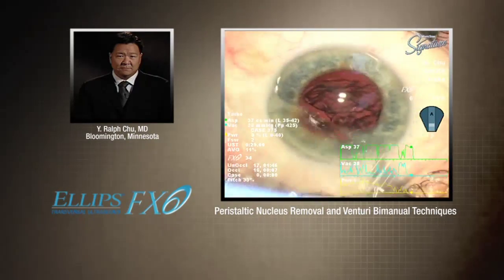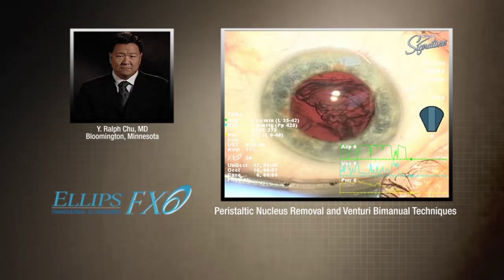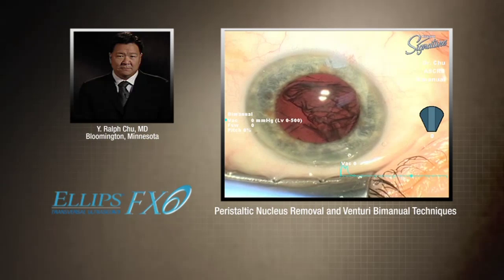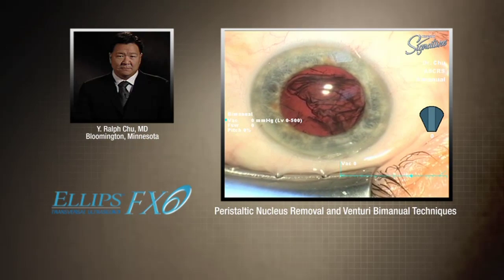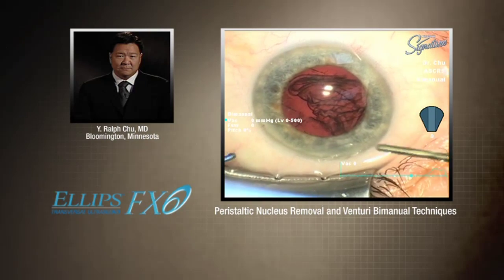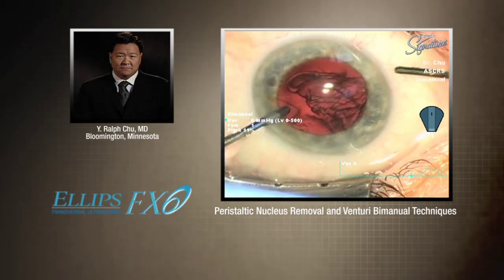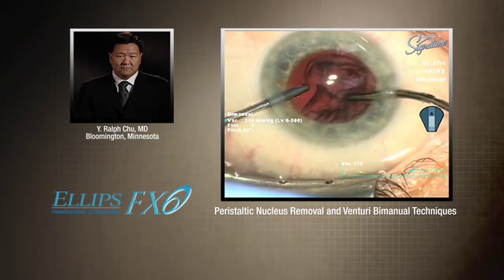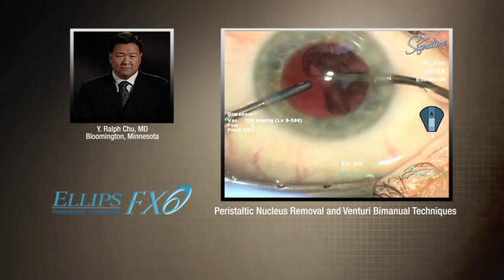One of the things you note is how stable the chamber is — you can see that based on the iris. Right now I'm just playing around. We also have the dual linear foot switch, so I was actually playing with the foot switch to switch to the different settings on my own without having to bother the scrub tech.